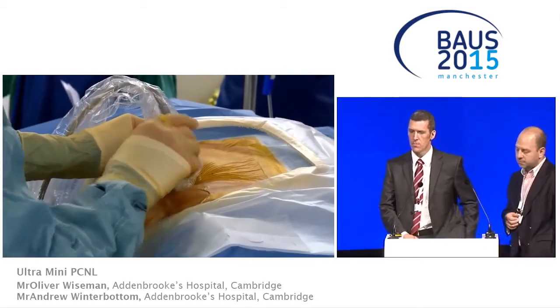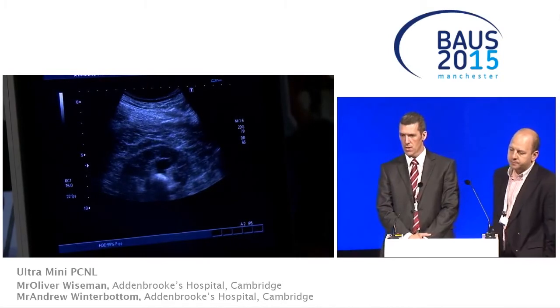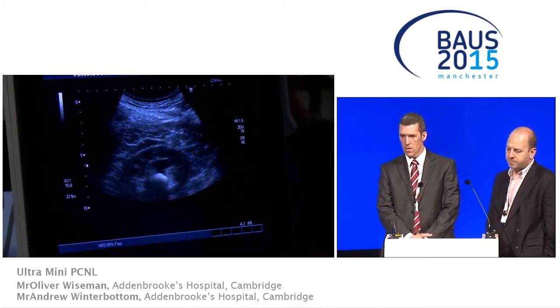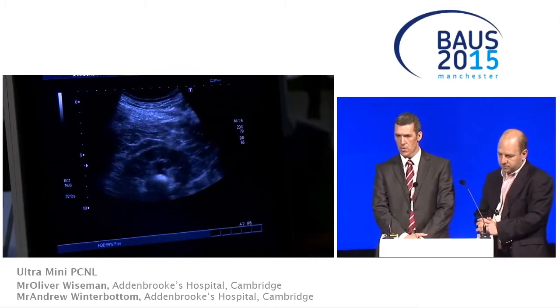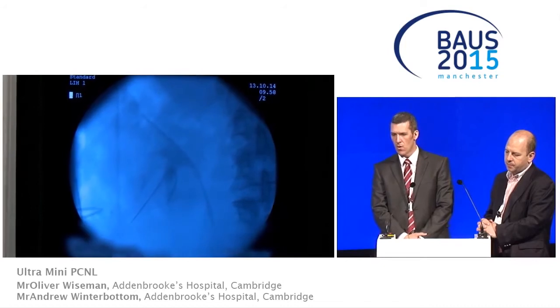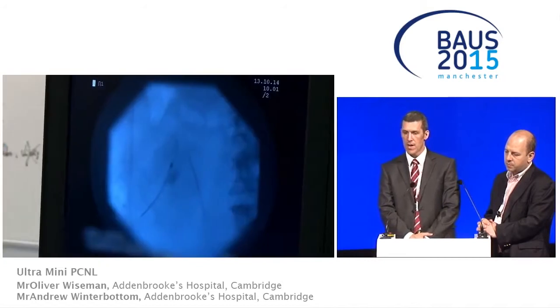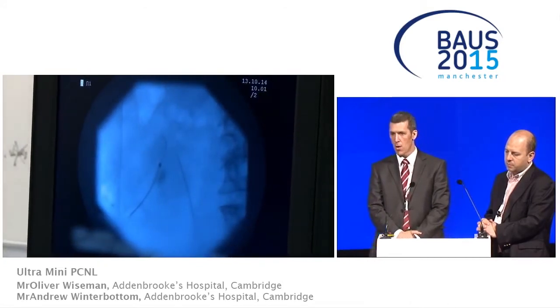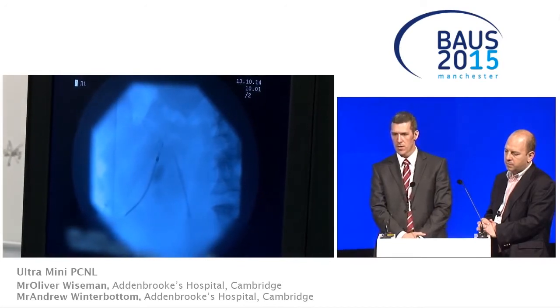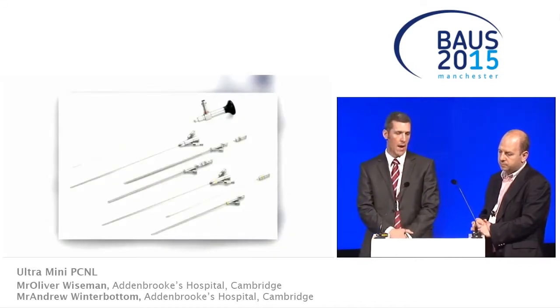You can see that there were some dilated lower pole calyx, as on the CT, so I've got a nice easy target to puncture there. You can see the echogenic stone. You'll see the needle coming through the cortex very shortly. Tip of the needle was in the calyx, and then we just carry on, manipulate a wire to the ureter alongside the ureteric catheter. That's a standard micropuncture kit, 018 wire to start. You'll see the wire flick shortly towards the ureteric catheter. Sometimes that requires a hydrophilic wire and angled catheter, but that time it just went straight down the ureter.